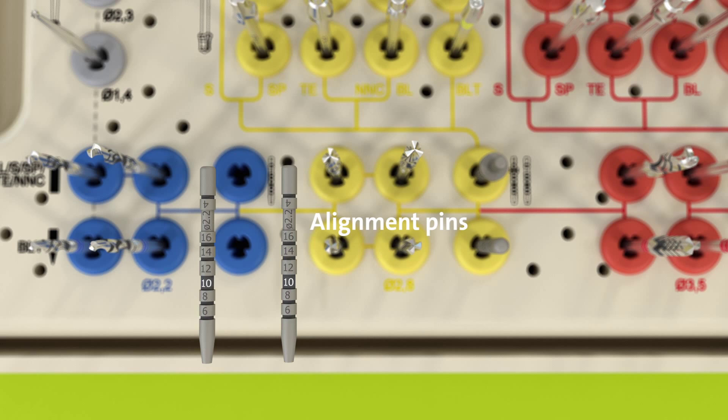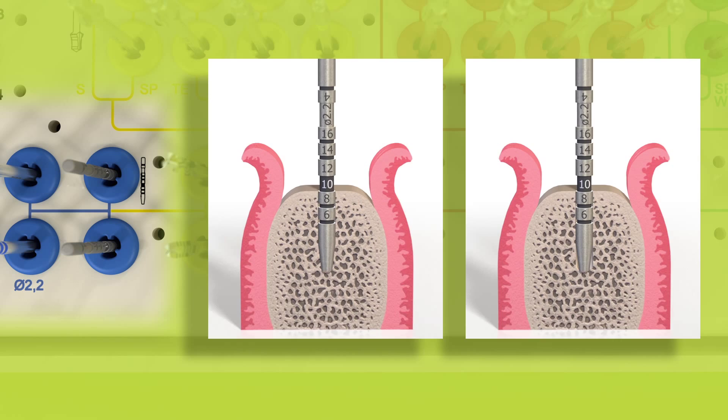The 2.2 mm alignment pins are also located in the blue inserts, next to the pilot drills. Alignment pins are used for checking the depth and the axis of the prepared osteotomy.